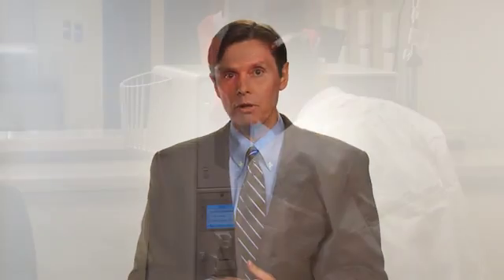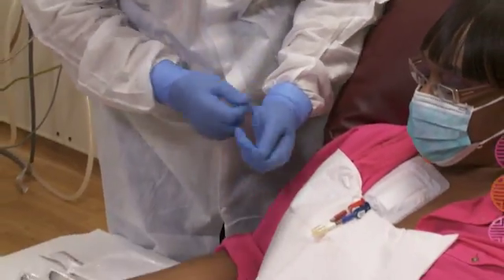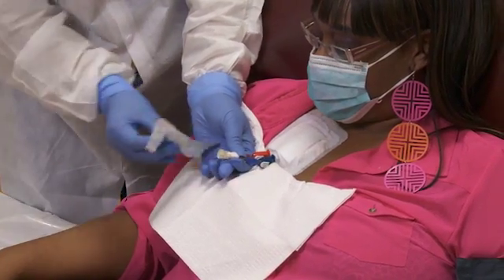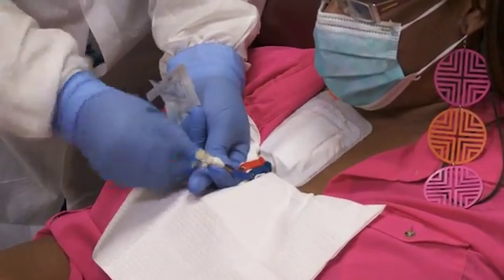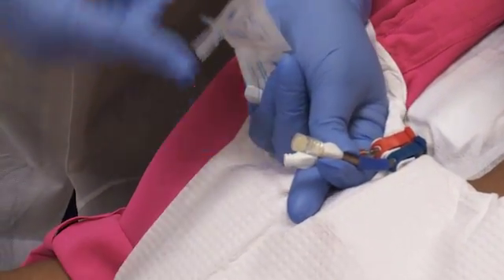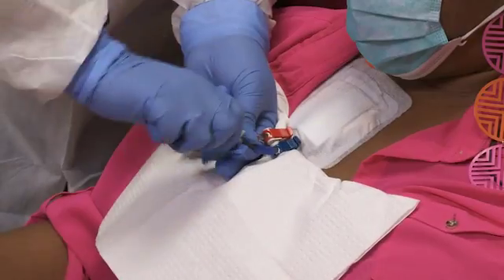To properly perform a catheter scrub-the-hub procedure during connection, use the following steps. Put on a gown and a face shield. Use a mask if required by facility policy. Perform hand hygiene and put on a new, clean pair of gloves — some centers may choose to use sterile gloves. Make sure to clamp both limbs of the catheter to prevent an air embolus. Remove the caps. While keeping the catheter clamped, apply antiseptic to each end of the catheter, which are the hubs, using a new, sterile antiseptic pad for each hub. Scrub the end and sides of each hub with friction, ensuring that all debris is removed.